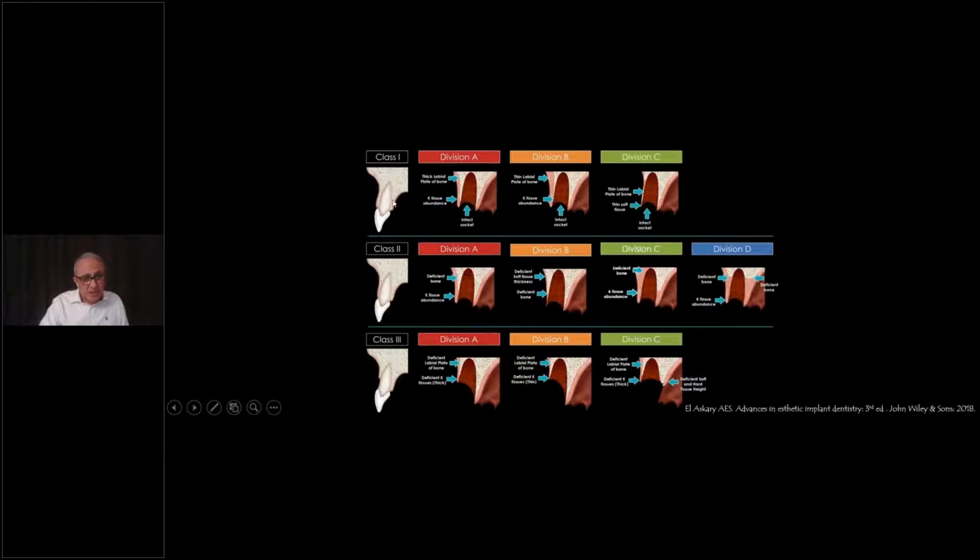Class 1, class 2. I've done a little bit of modification that I've published in my previous book. I put subdivisions into this classification to distinguish between thick and thin tissues, thick and thin bone, presence or absence of the palatal plate of bone and labial plate of bone as well, as well as class 3. This is what we have published recently, just to enable us to communicate and maybe define.